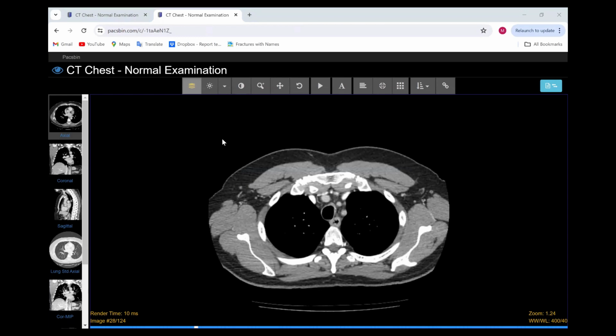Good evening, everyone. My name is Mohammed Aljuraysi. I'm an R3 resident in King Khalid University Hospital. Today, inshallah, I will give you a brief introduction into CT chest imaging by reviewing anatomy. Also, I will show you common cases in daily practice.